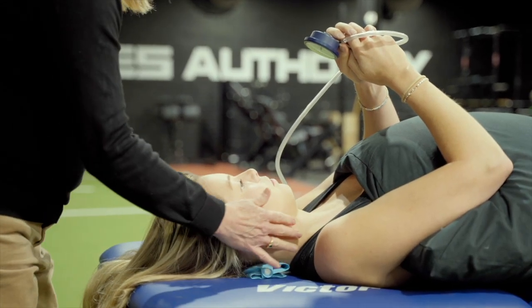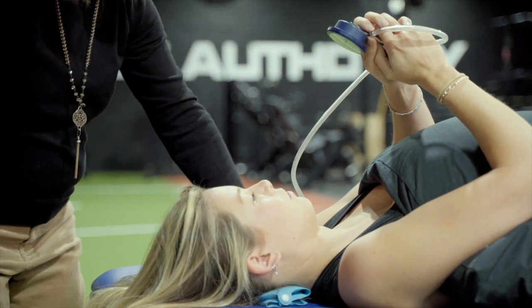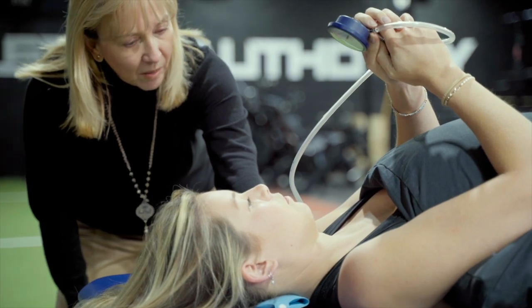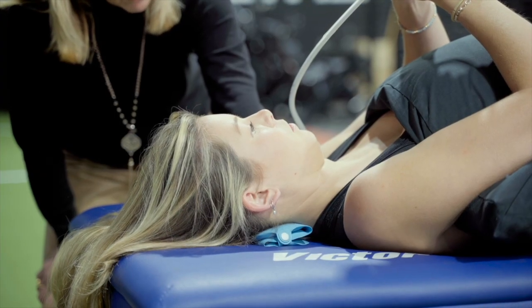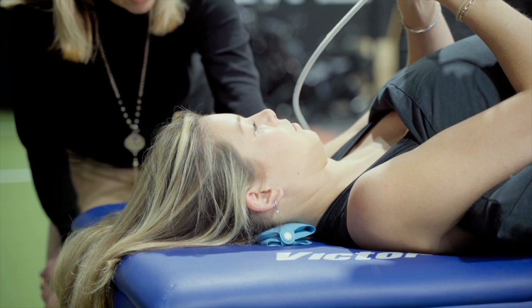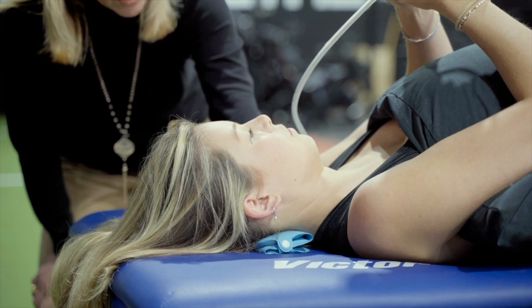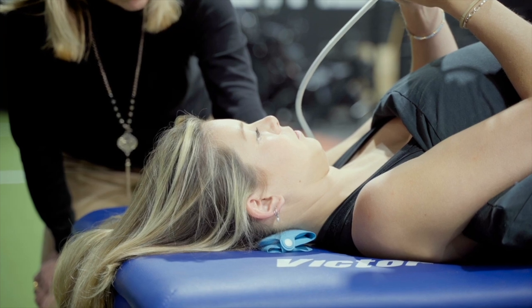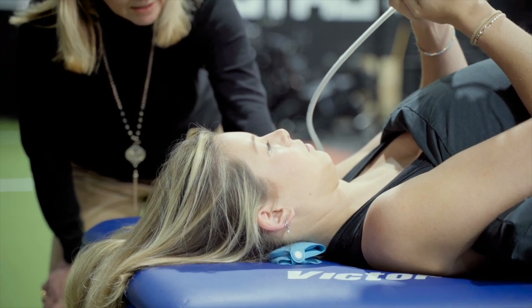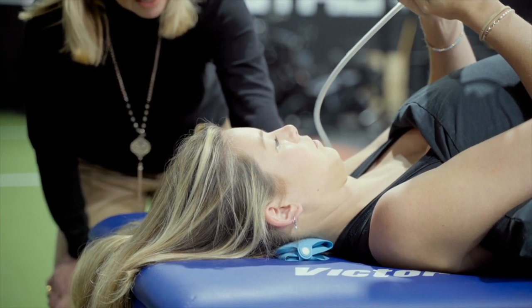We've already worked out that she could go to 24, but 26 was where she started to have a problem. So we'll get you to just nod to 24 and relax. Remember: look down and slide, just nod to 24, hold, and try to keep the pressure steady, and relax. Now look down and nod to 26, hold, and relax. Look down, nod, hold to 26, and relax.